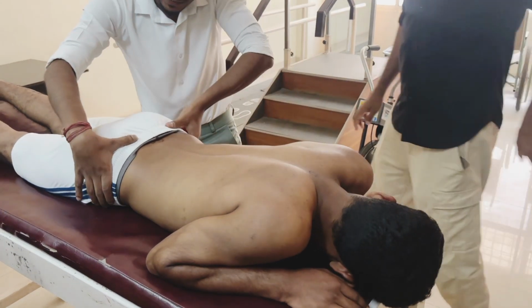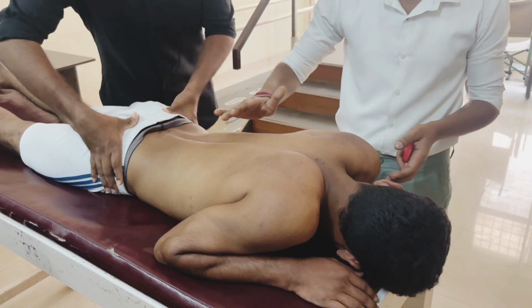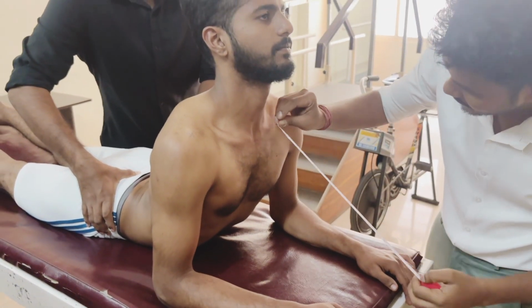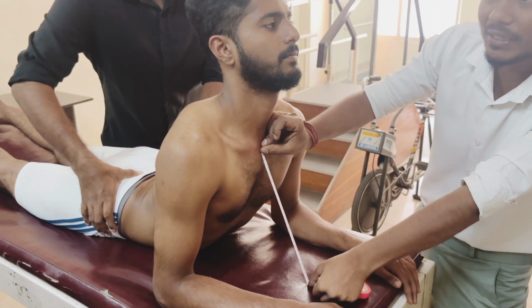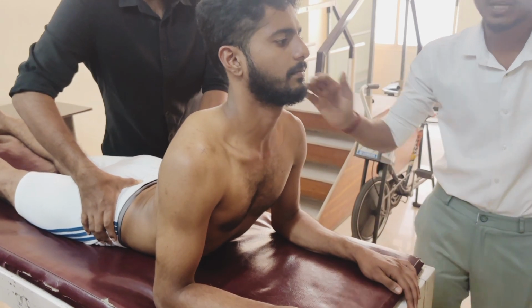Just stabilize his pelvis. So we have to stabilize the pelvis. Then we will ask the patient to go for extension. When the patient goes for extension, we are going to take the distance between the sternal notch and the bed. Then we will tell this is the extension range of this patient.